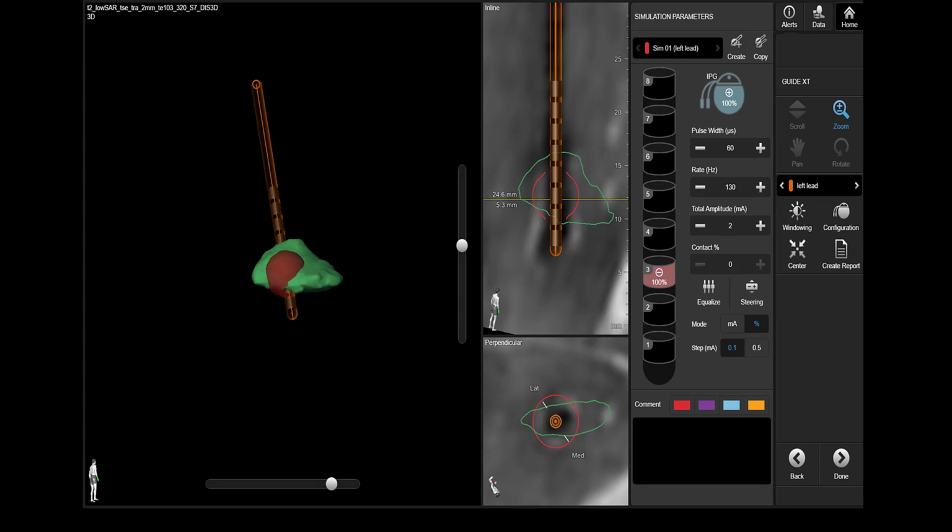With the new systems for visual guided programming, we can actually look at an image of the local anatomy in the form of an MRI investigation and the electrode based on postoperative investigation. The locations of the electrode contacts will further be displayed in this image, and probably with high fidelity.